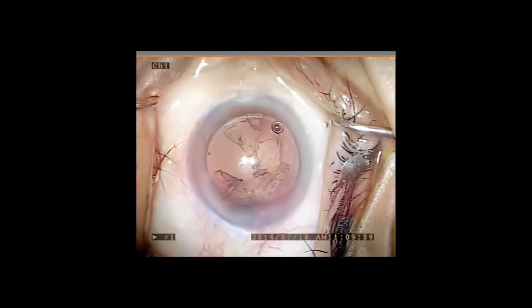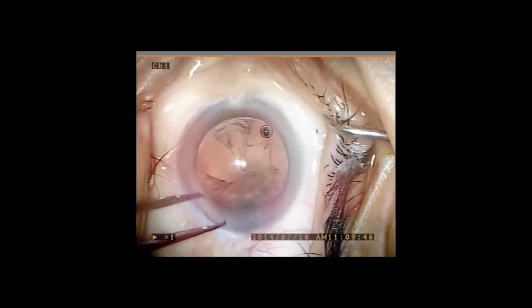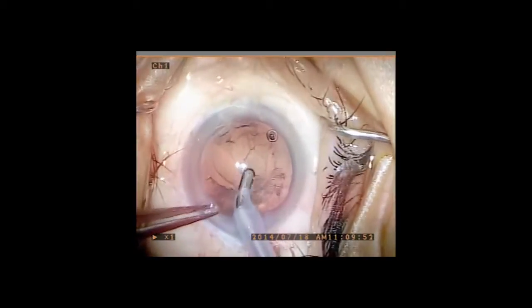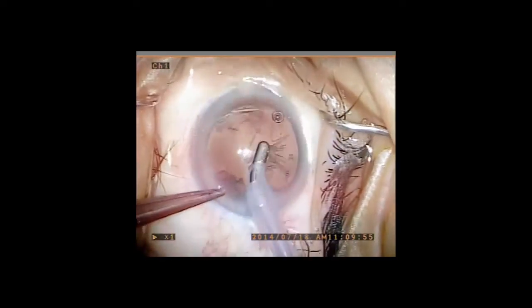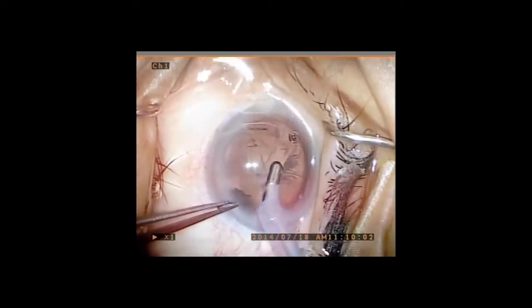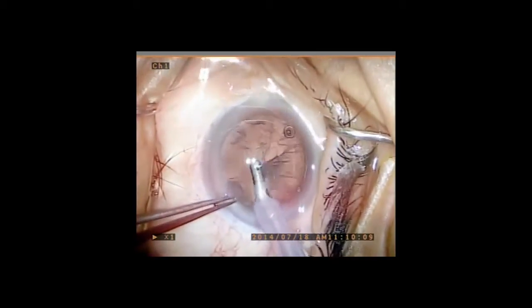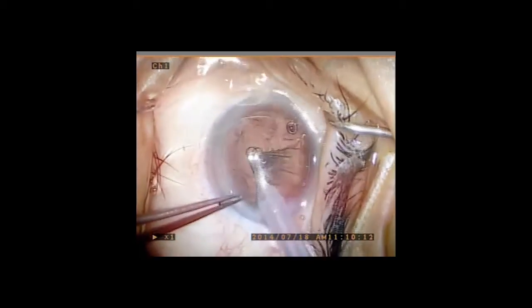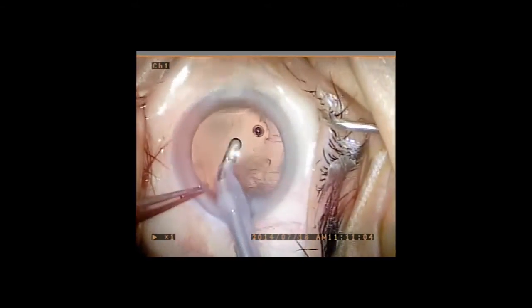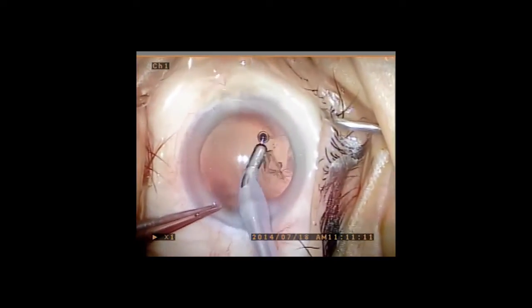The removal of cortex is then achieved by centripetal and tangential manipulation of the IA handpiece in order to remove all cortex, which is trapped in the fornices of the capsular bag. At this point, viscoelastic is placed into the capsular bag, being careful not to overexpand it.